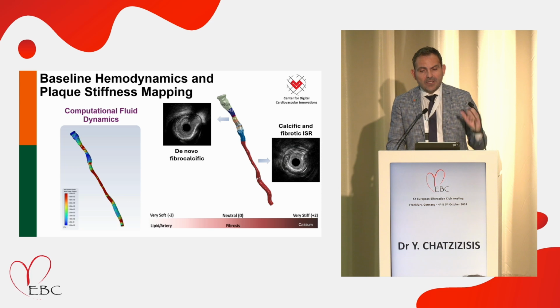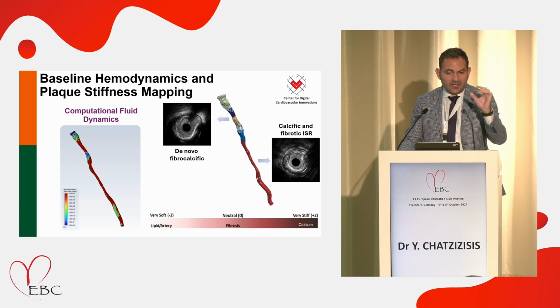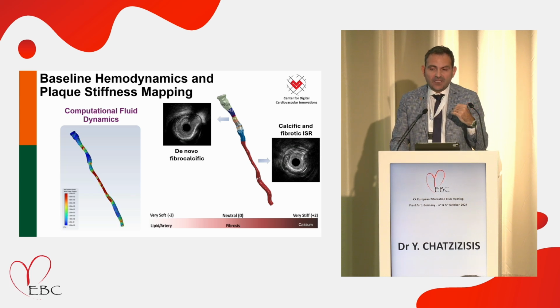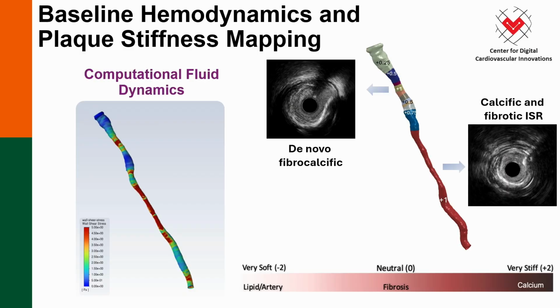What we do now is use this information, first of all, to assess the hemodynamics. You see the flow acceleration in red in the proximal de novo stenosis, and also distally in the long in-stent stenosis. We also assign patient-specific materials. Proximally, it is based on this spectrum here. It's on the red side, pretty calcified, pretty stiff, if you want.